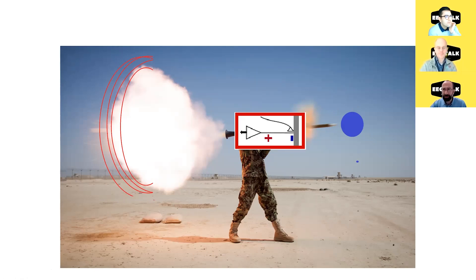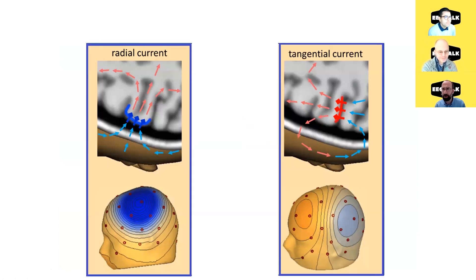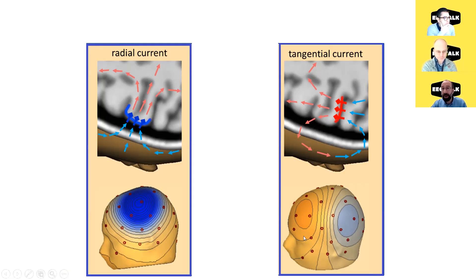Let's try it out in practice. You click with your cursor on a point in time in the EEG and the software reconstructs a two-dimensional or three-dimensional image of the negativities and positivities on the skull. Color codes are used: blue symbolizes negativity — the deeper the blue, the higher the negativity — and red is for positive potentials, with deeper red indicating more positivity.